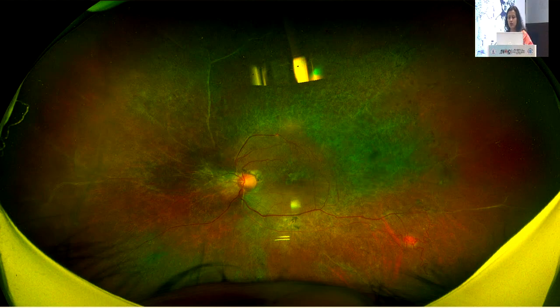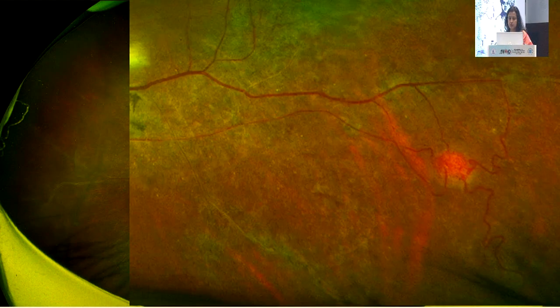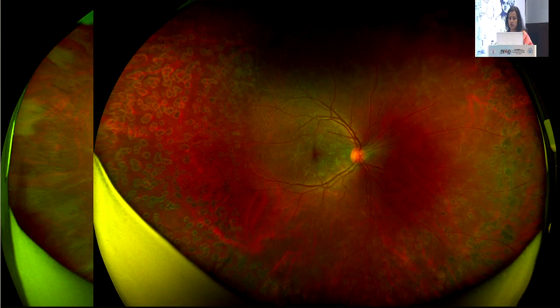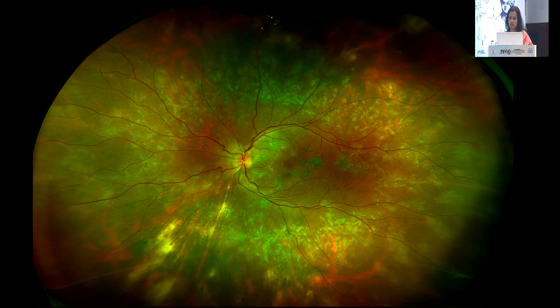This is a sequelae of syphilitic panuveitis. You see a VPT here on closer examination there. Again, beautifully shown. This is idiopathic retinal vasculitis, again pre here and post laser. You can see good stabilization of the disease. Serpiginous-like choroiditis. Our uveal ocular inflammation department is super thrilled with this device.